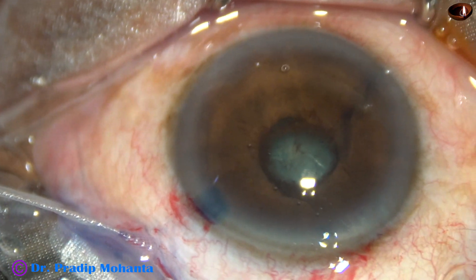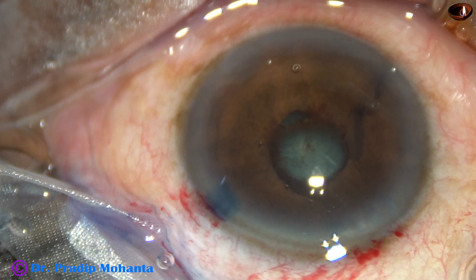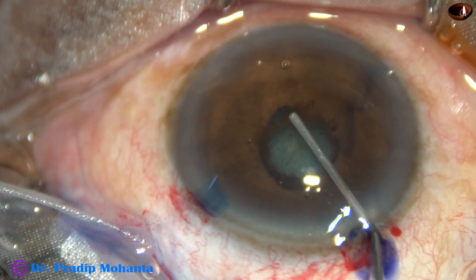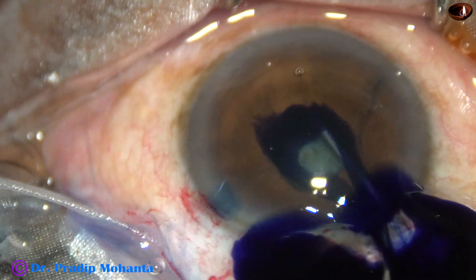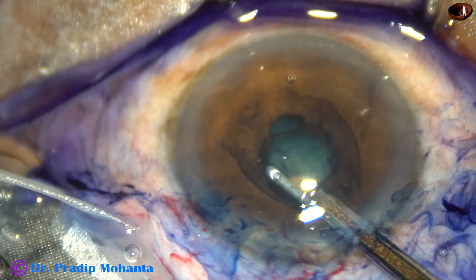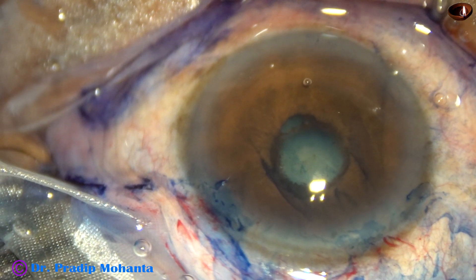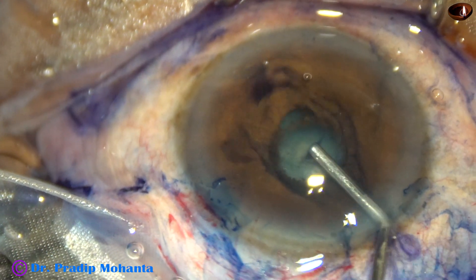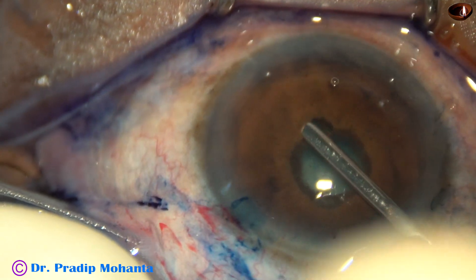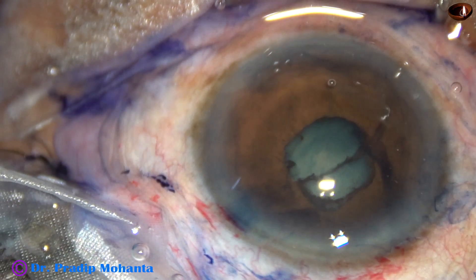Yes, I have made an opening. And now I have asked for the dye and I am going to inject dye through this gap so that there is uniform staining of the anterior capsule. I have washed the dye again but it will not wash out all the dye. I inject visco — 2% HPMC — and now I can go through this gap with the iris spatula and break the synechia almost more than 180 degrees.